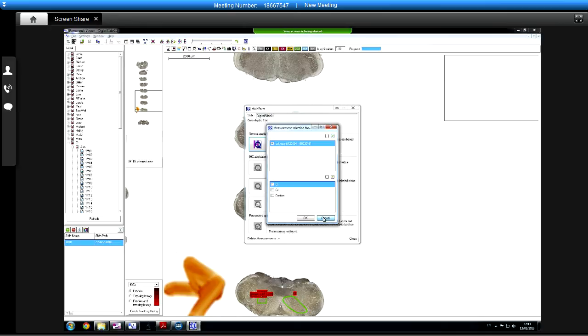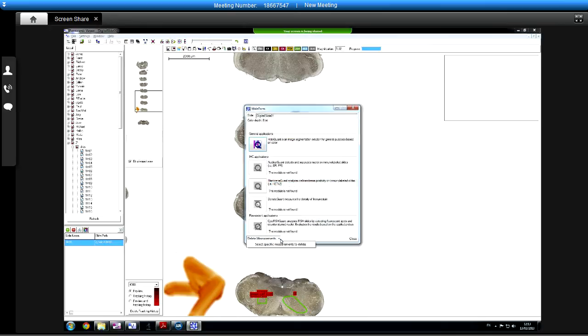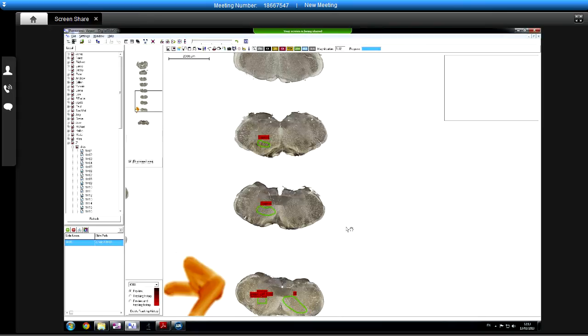Okay, does that all make sense and seem useful at the moment? Make sense to you, Roger? When you were playing before, was there anything specific that came up in terms of questions? No, I mean, it's just not very intuitive. No, it's once you know how it works. When you think you've started it, and you think, oh, it'll pop up on the thing, and it doesn't. So you have to click on the little I button to get it. Oh, because they're all saved with different layers. And that sort of thing.